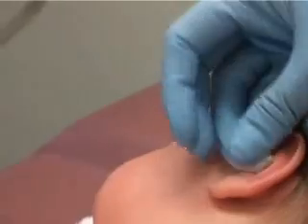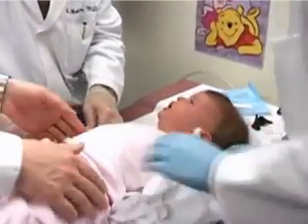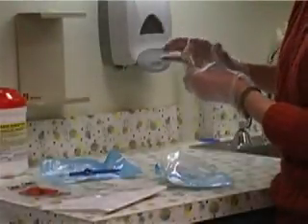Place a small cotton pledget in the external auditory canal to absorb any remaining blood or pus and release the child from the restraint. Remove the plastic receptacle from the tympanocentesis aspirator, cap it, and send the specimen for microbiologic evaluation.